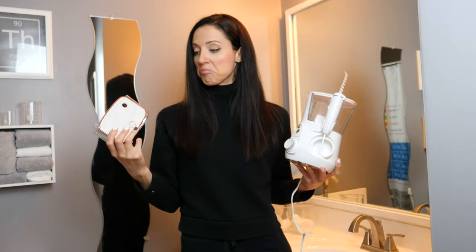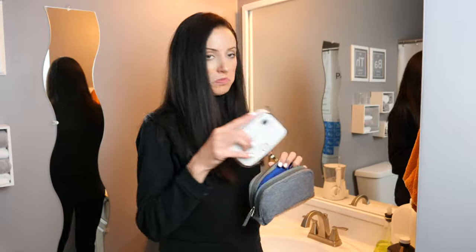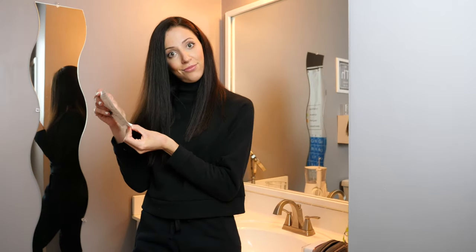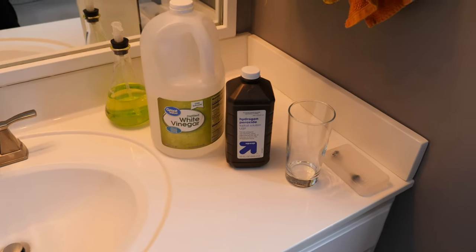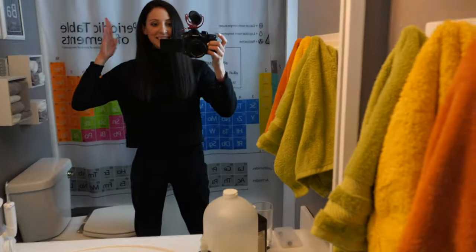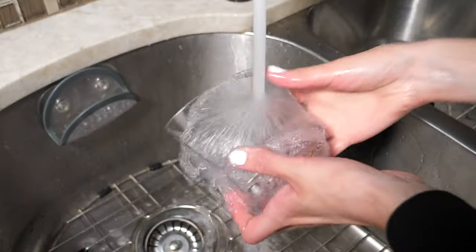There are lots of different makes, models, and brands that make a bunch of different water flosser type machines. So always please keep in mind to read your manufacturer's directions on how to properly clean the one that you own. This video is going to show just what I do with mine, and it doesn't mean you should do it with yours. Always check the instructions of your specific unit.